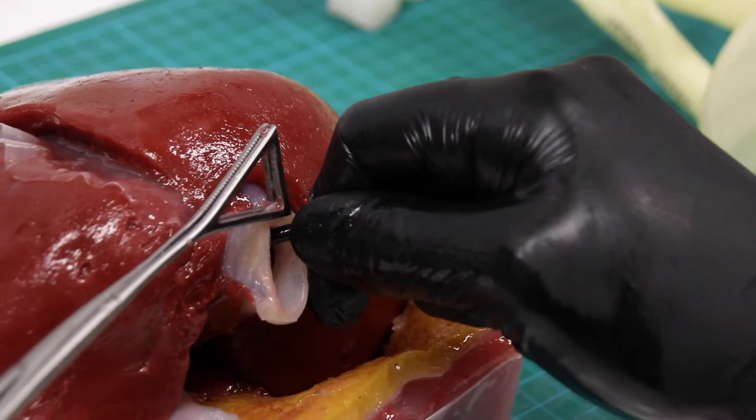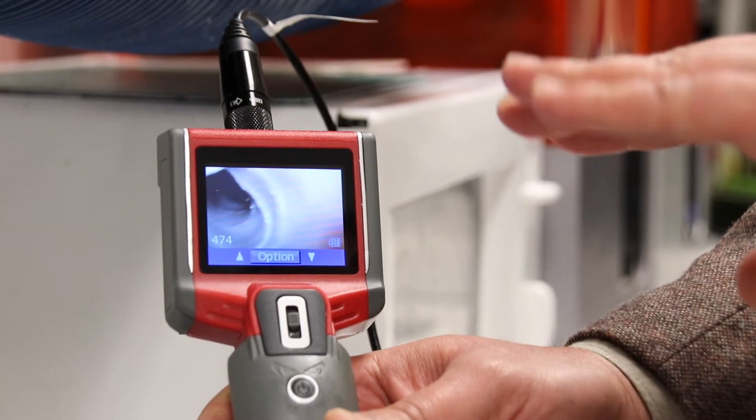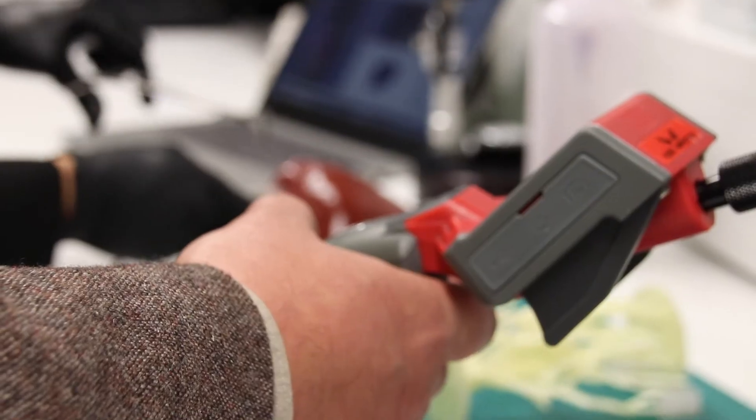So the organ is able to be palpated by the surgeon or a device to be able to pinpoint exactly where that tumor is in the organ, and then it's able to be operated on using that information.